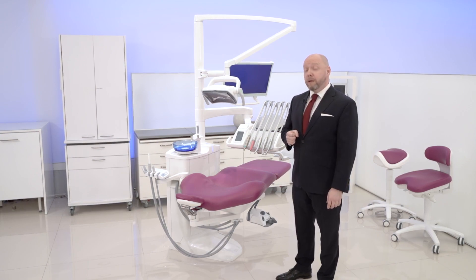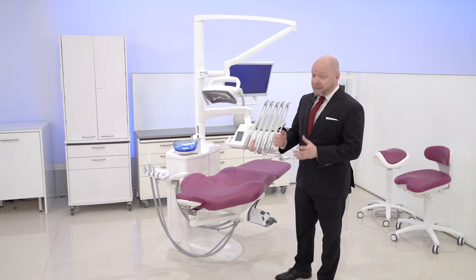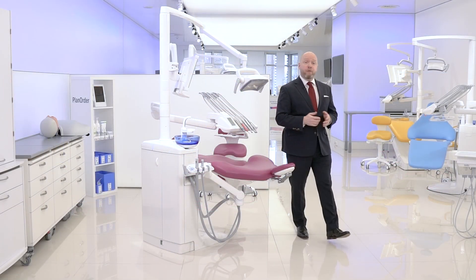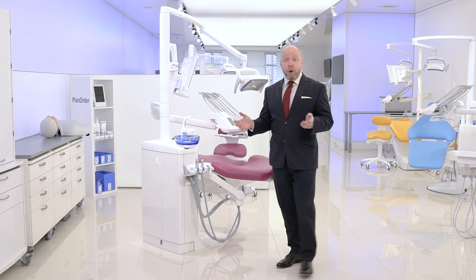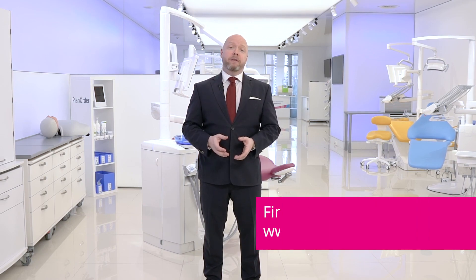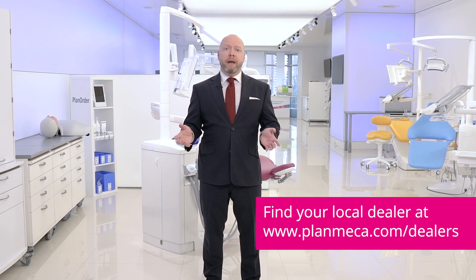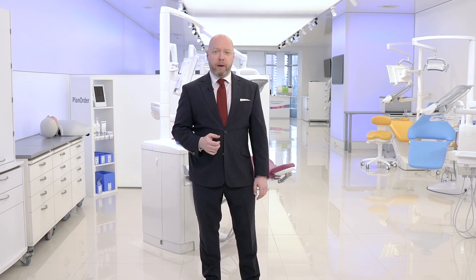And that's it really — a brief overview of our most popular dental care unit. If you have any questions, don't hesitate to contact your local dealer or visit our homepage at planmeca.com. Thank you for your time.